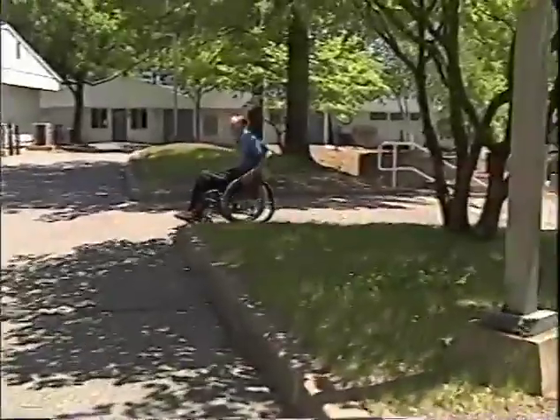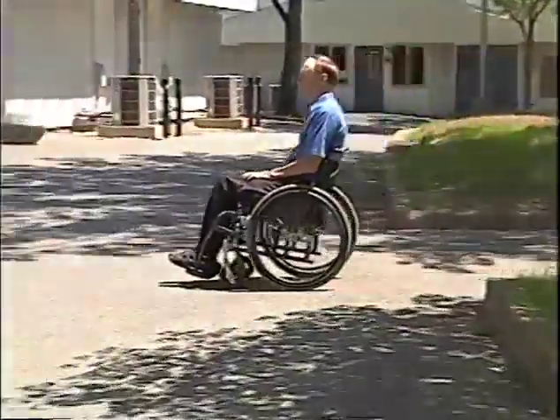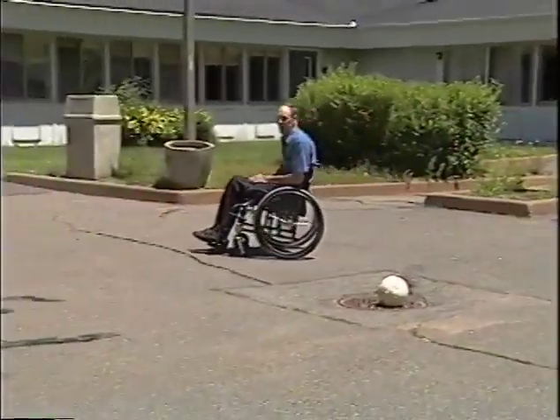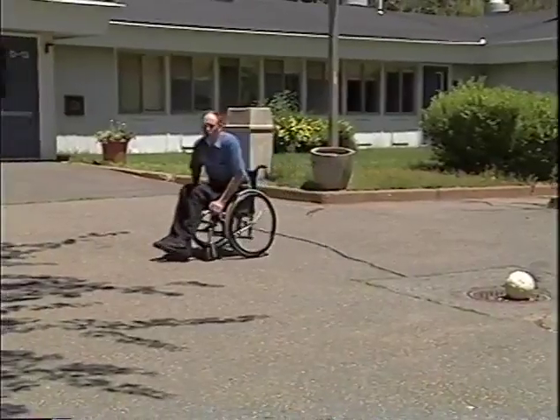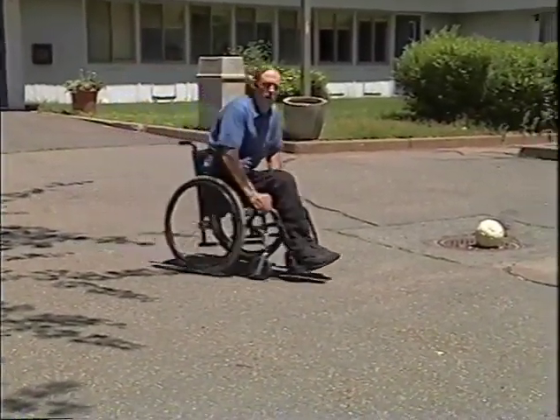If you go a little bit faster with your wheelchair, you'll find out it still has an effect, but not as much. And if you want to follow the road, put more weight on the front end, and you'll begin to follow the road more.